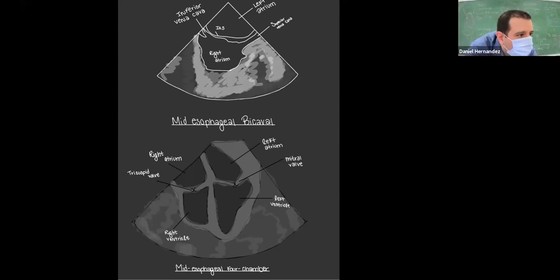That is 90 degrees to 110 degrees. Okay, 90 to 110. That's all I have for that one. Did you want to add anything, Dan?